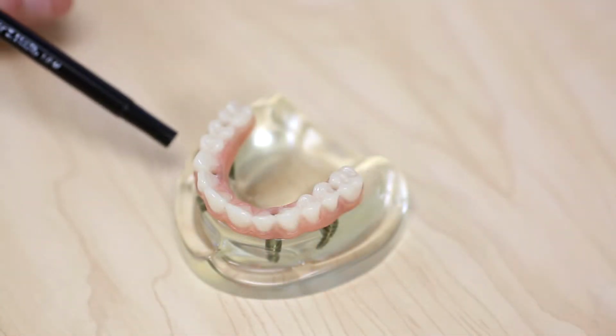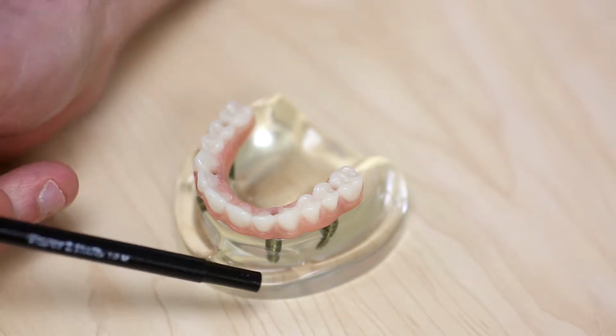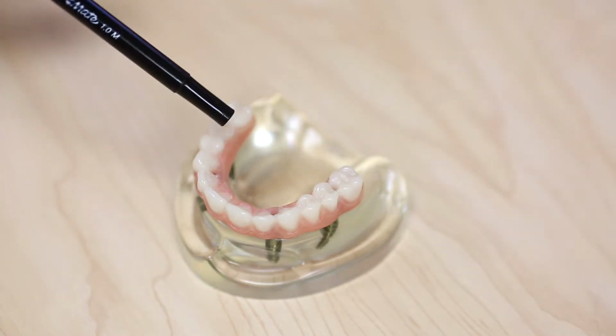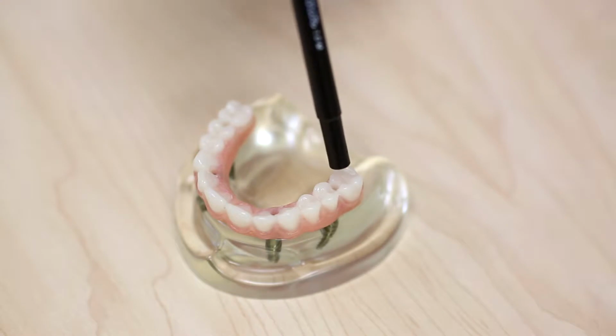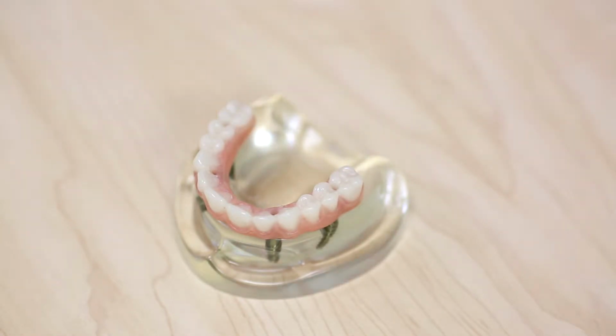What exactly is an all-on-4 procedure? As you can see from this model, essentially it means that 4 dental implants are placed into the dental arch. This allows for the subsequent insertion of a dental bridge, which actually gets screwed into those 4 implants with the little screws which are hidden inside of the teeth.